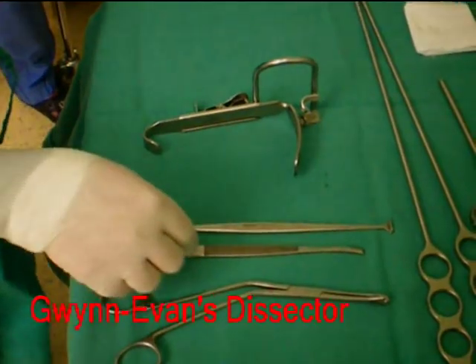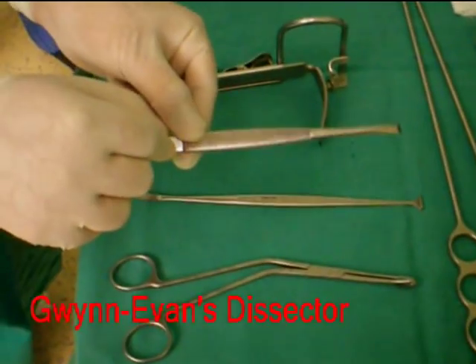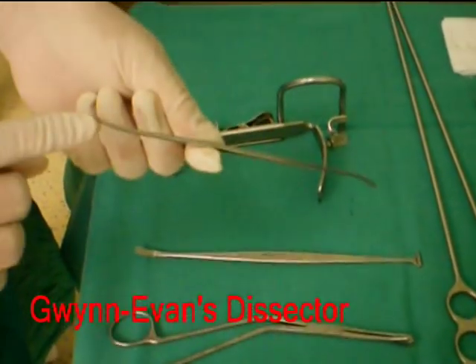This here is a Gwyn Evans dissector, used to dissect the tonsil along its capsular plane. It has a toothed and a non-toothed end, as shown.